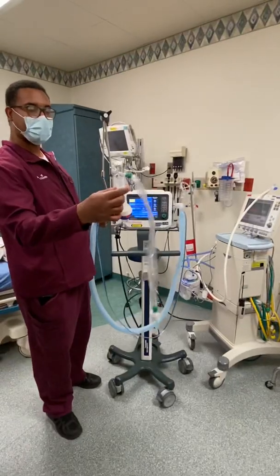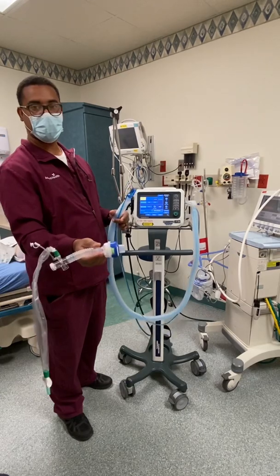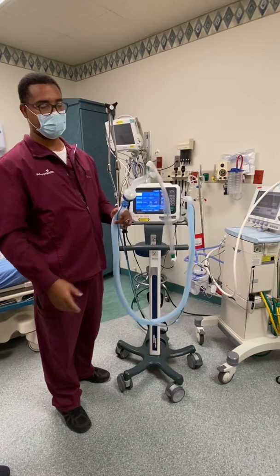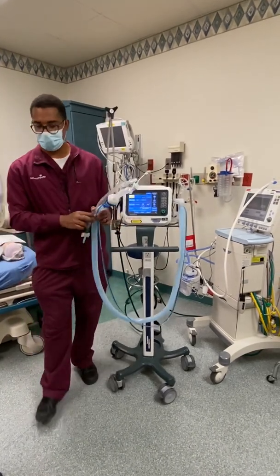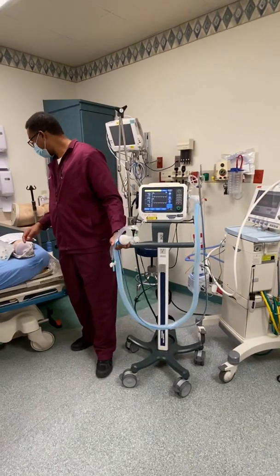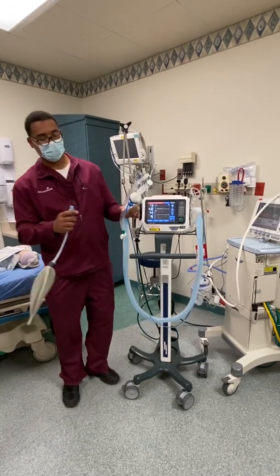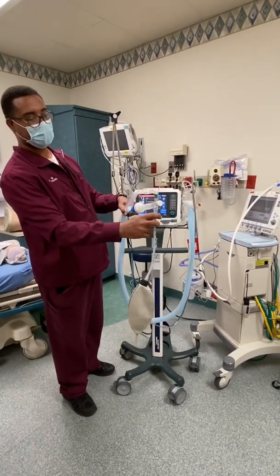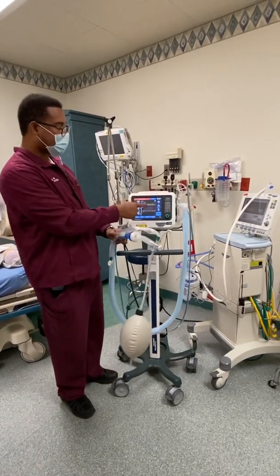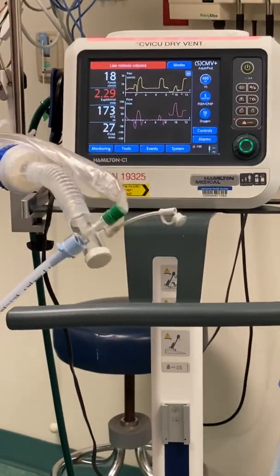The other attachment is the filter and the HME. You want to make sure it's set to HME and attach it there. Now it's ready to be placed on the patient. Start ventilation. This would be the patient tube, connected right there. The next button you want to know is Alarm Silence, to use while you figure out what's happened to the vent.